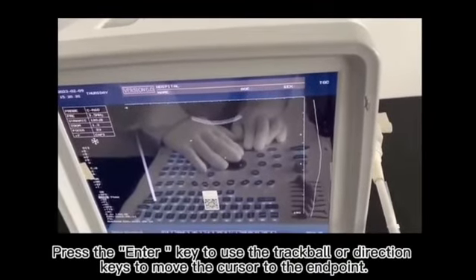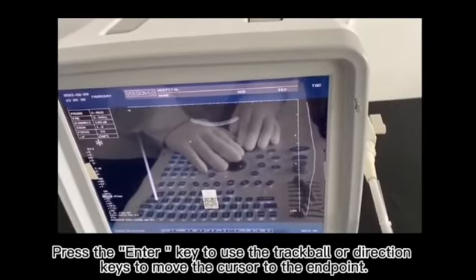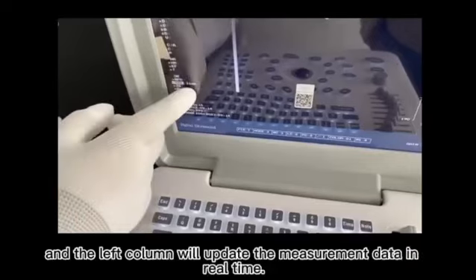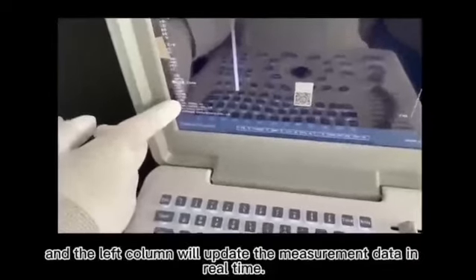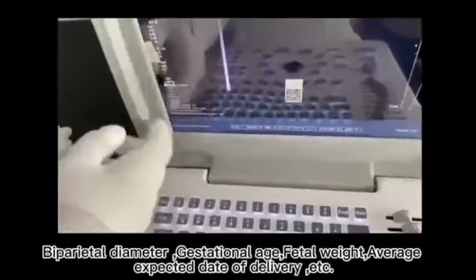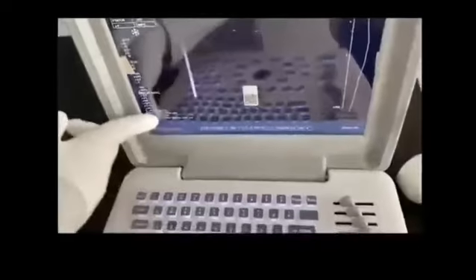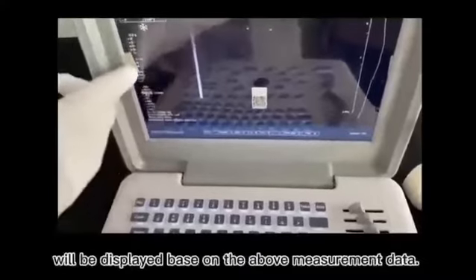Press the Enter key, then use the trackball or direction keys to move the cursor to the endpoint. And the left column will update the measurement data in real time. Biparietal diameter, gestational age, fetal weight, average expected date of delivery, etc. will be displayed based on the above measurement data.